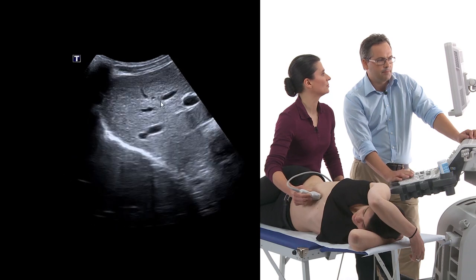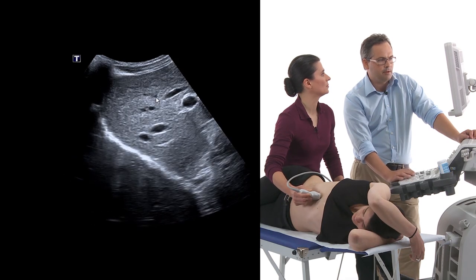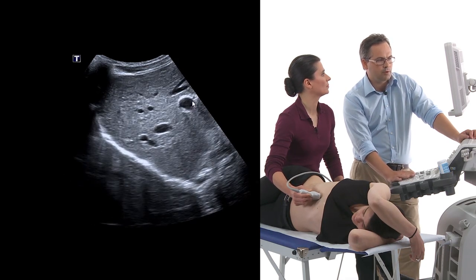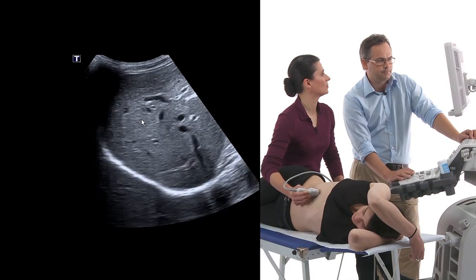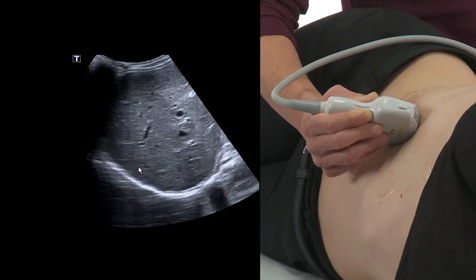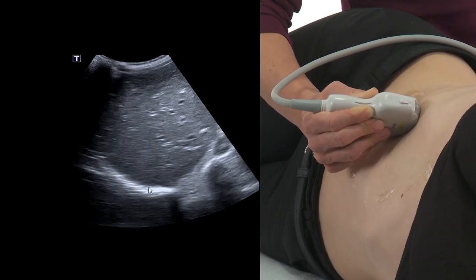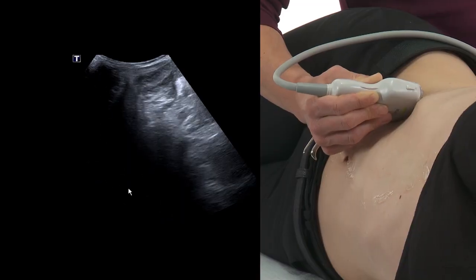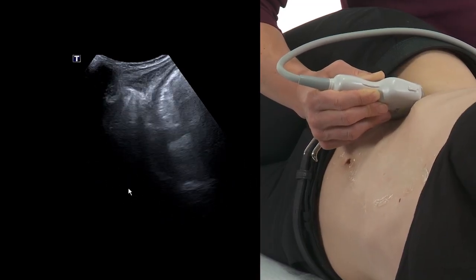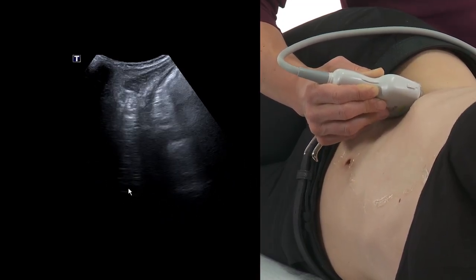Over here, the liver vein and branches of the portal vein over here, with bright echoes in the wall. Keep my focus on the cranial parts of the liver now. You can see the diaphragm over here. Until the very right rim. Exhale. Perfect. And inhale again, please.